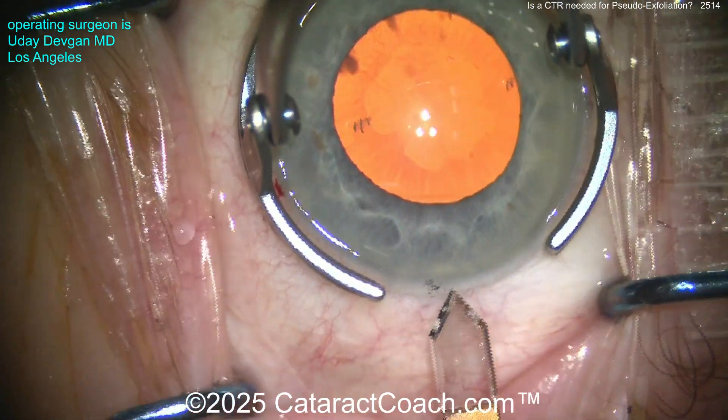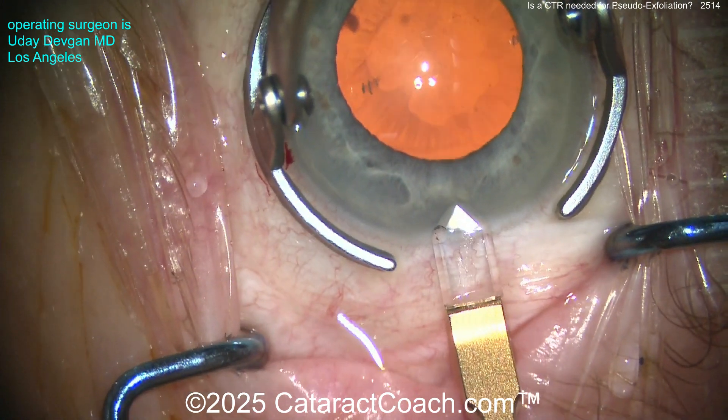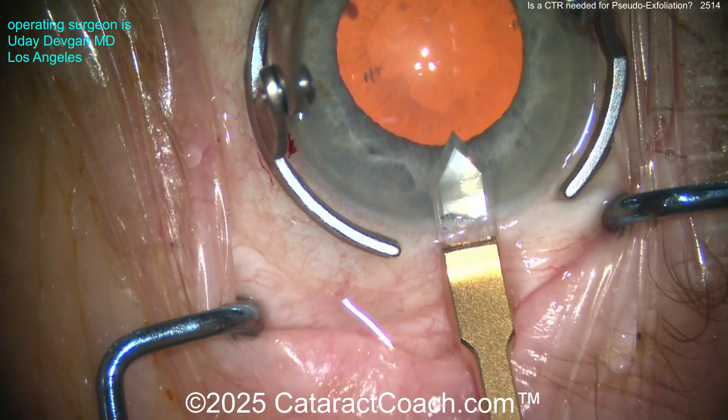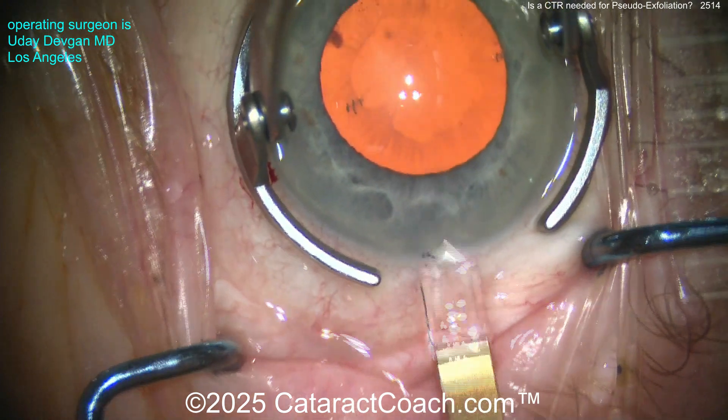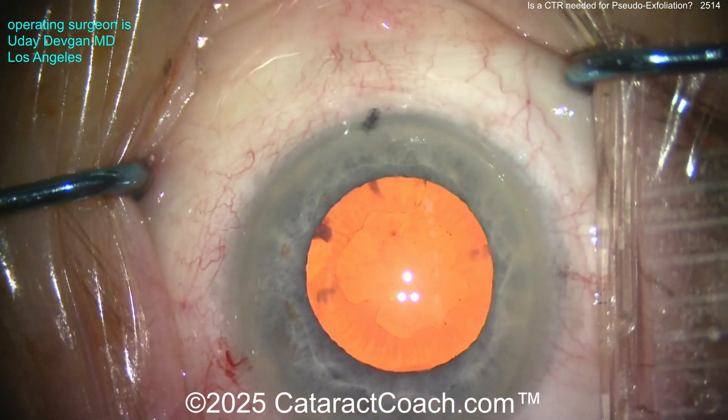Now let's make our phaco incision. I like my diamond, so making a diamond incision here — that's a two-millimeter keratome. Put that in, get a nice single-plane, good tunnel length, slightly enlarge it to about 2.2 to 2.4 millimeters. Now it's time for the rhexis.